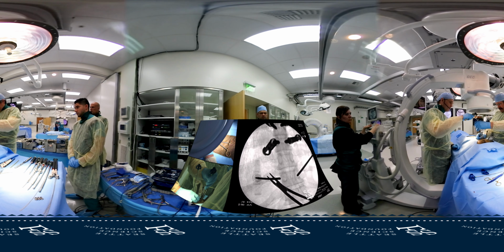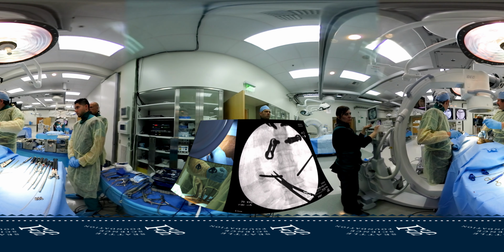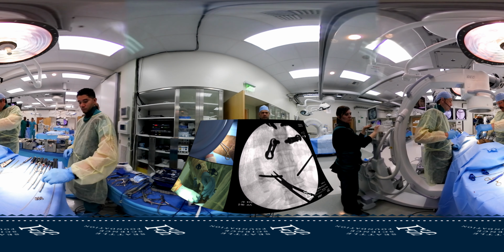Go ahead and tap it in and let's see what it looks like. So, oh, it slid. Hold on. Let me try it one more time here. Okay, that's not bad. Go ahead. So we'll tap them in, and we'll get them just so they'll stay in the bone.